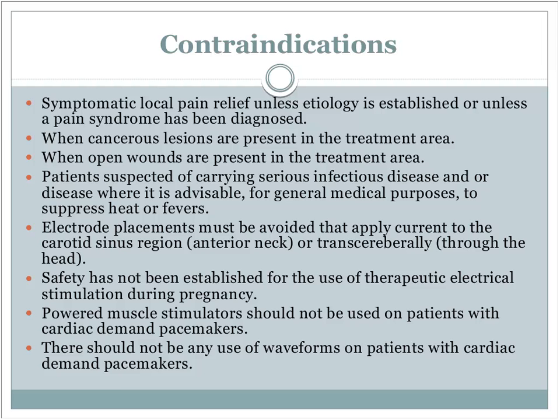Waveforms on patients with cardiac demand pacemakers. It says you shouldn't use any waveforms. That comes directly out of the manual for the machine, and I'm going to say that it's probably not a bad idea to pay attention to that, although have I done TENS on somebody's knee or ankle? Yes. But basically keep in mind, if somebody has a pacemaker, maybe we shouldn't be doing TENS or eStim or ultrasound on them.